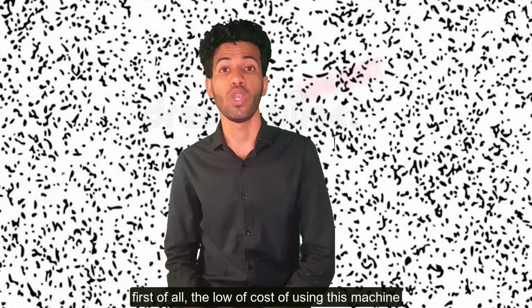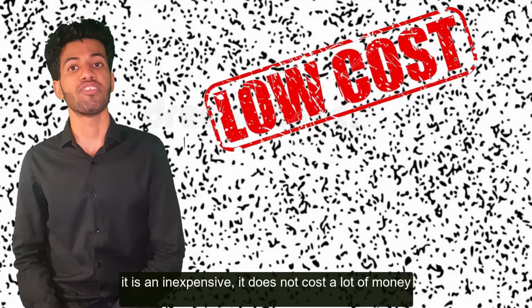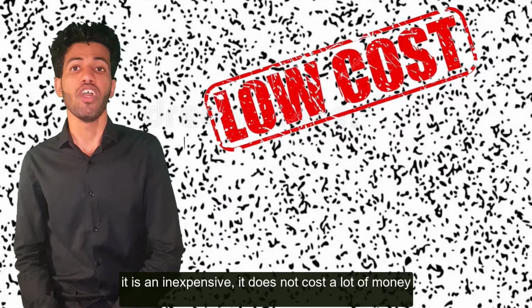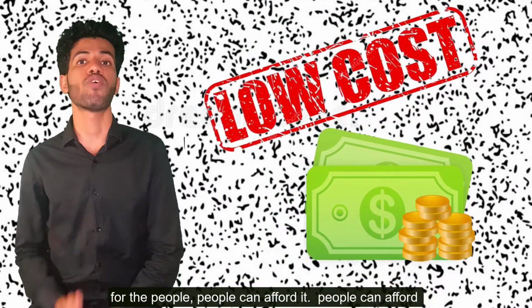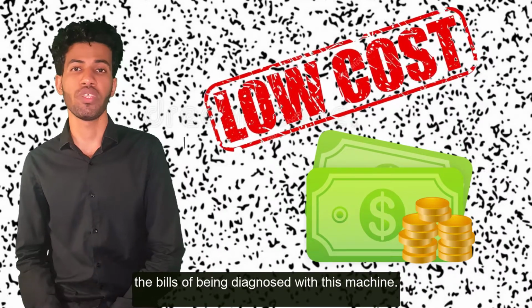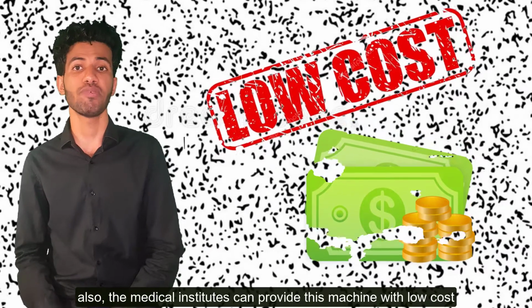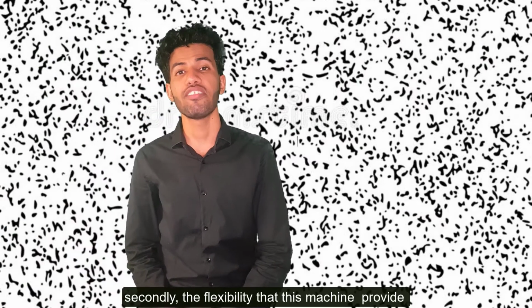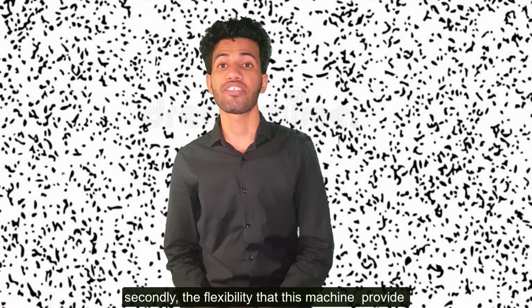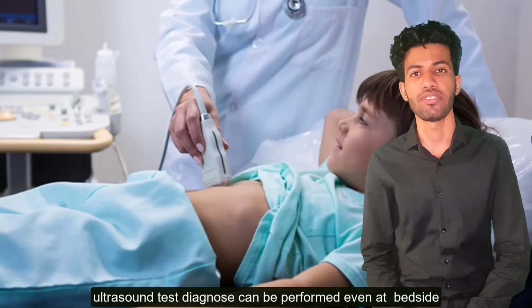First of all, the low cost of using this machine. It is inexpensive, it doesn't cost a lot of money. People can afford the bills of being diagnosed with this machine. Also, the medical institute can provide this machine at low cost. Secondly, the flexibility that this machine provides. Ultrasound diagnosis can be performed even at the bedside.